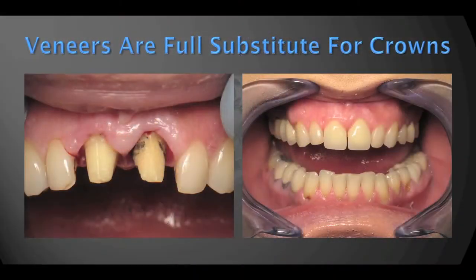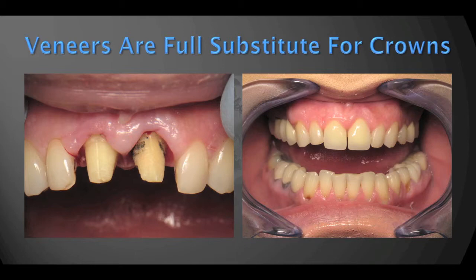Porcelain veneers are way more than just for aesthetic purposes. In fact, porcelain veneers are a viable substitute for full crowns. In my practice, I haven't prepped a full crown in the anterior area — I don't remember when was the last time I did this. Unfortunately, traditionally we tend to repair damage to a tooth like we see on the screen. This patient had two crowns in the centrals because she had a severe fracture in one of them, and you can see the damage caused by the preparations. The gingival is very unhealthy.